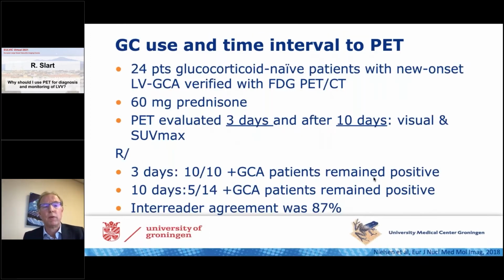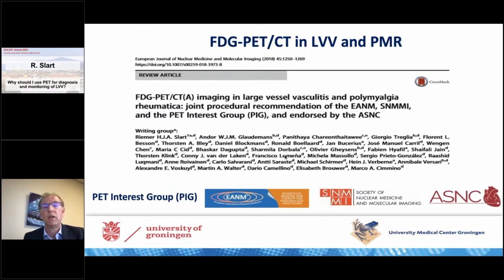But be aware of steroids, prednisone. The study also proved that until 3 days, the signal is still highly active on PET imaging. But if you treat the patient longer than 3 days, the signal will reduce on the PET scan. And all the procedures are described here in this procedural paper, combining imagers with rheumatologists to increase your performance to the highest level with PET imaging.